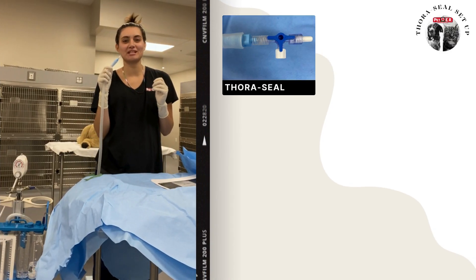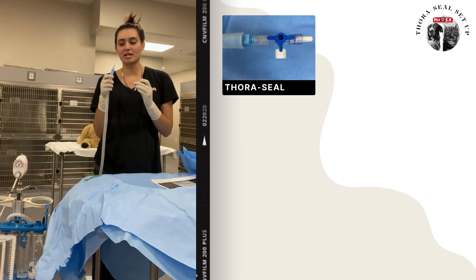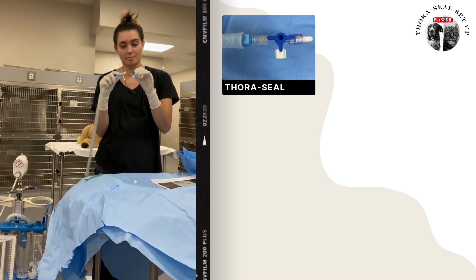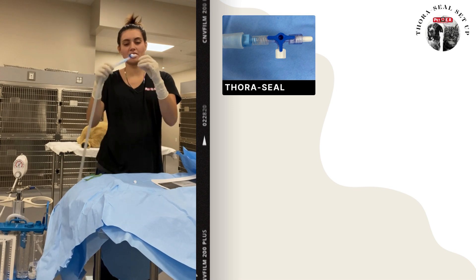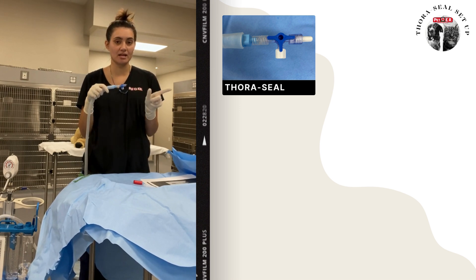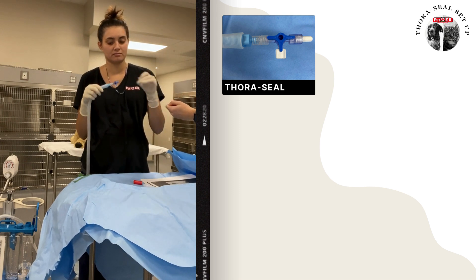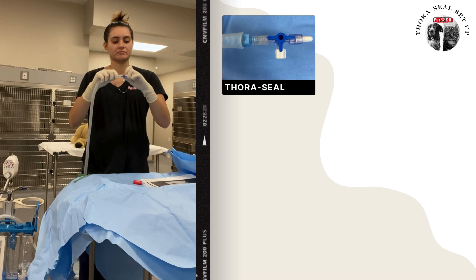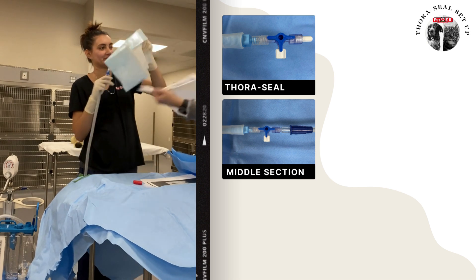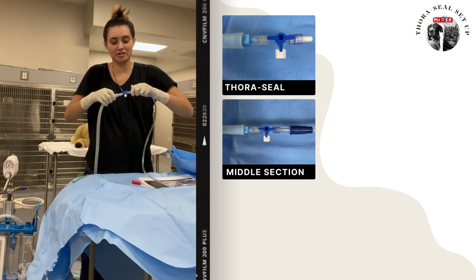Now your buddy is going to hand you a stopcock. Because she handed us a male already, it's going to go on the female side of our stopcock — so it should look like this so far. Your buddy is then going to hand you a female Christmas tree, and these can be the clear ones. That will attach onto this end of the stopcock, and then they will sterilely hand you another suction tubing.